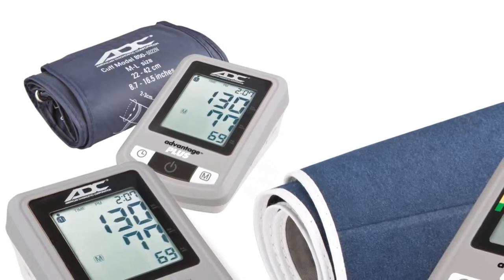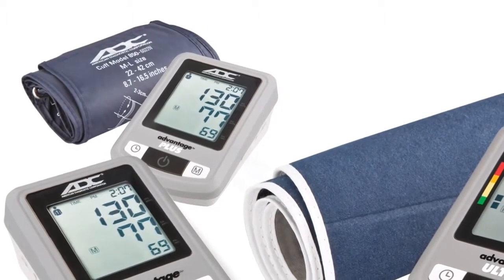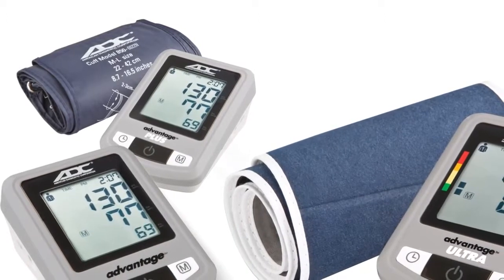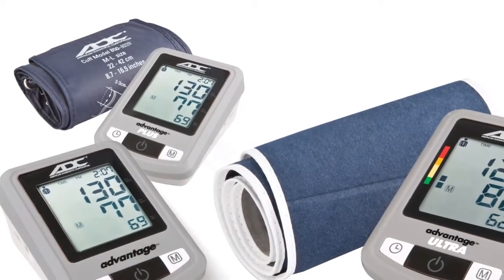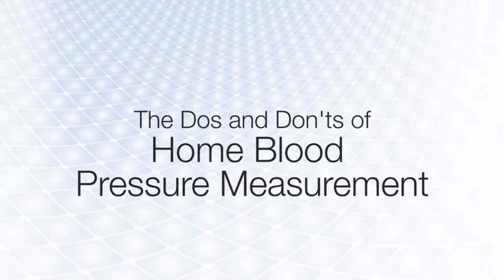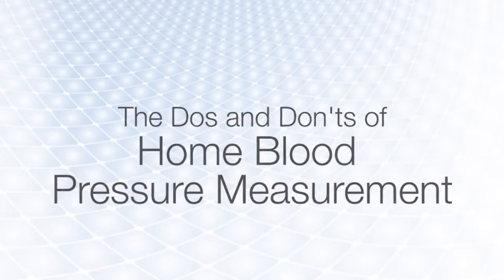Home blood pressure monitors are an easy way to track your blood pressure between doctor's visits. To get the most accurate measurements, it's important to use your blood pressure monitor properly. This video demonstrates some of the best practices for using at-home blood pressure units.